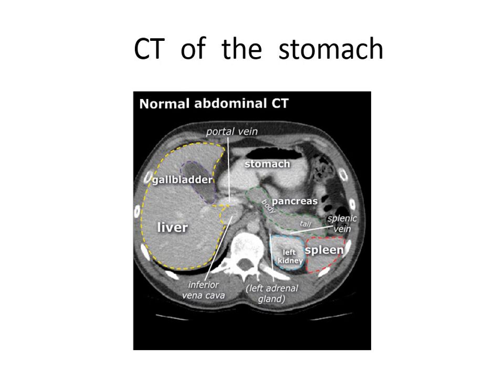On CT of the stomach in cross-section, we see the stomach with the pancreas posterior to it, the left kidney and left adrenal (inverted Y-shape), the spleen, the anterior abdominal wall, and the left lobe of the liver anterior to the stomach.